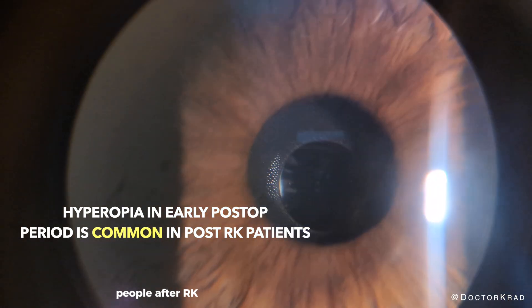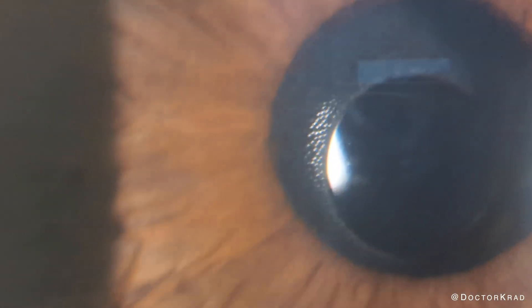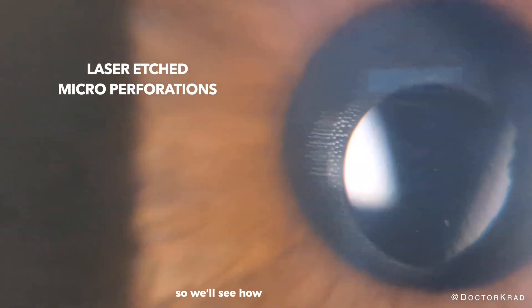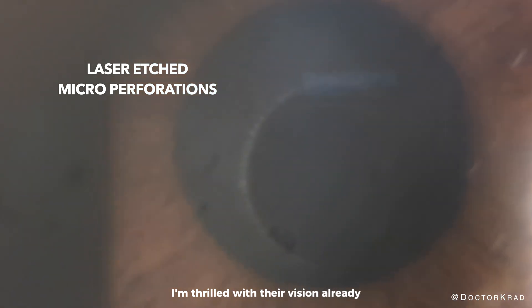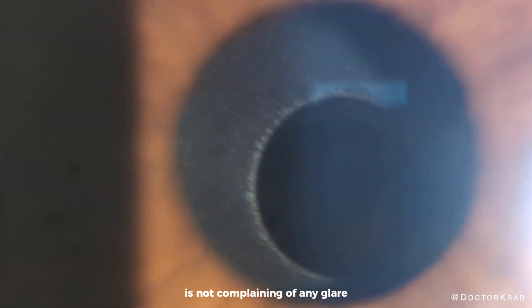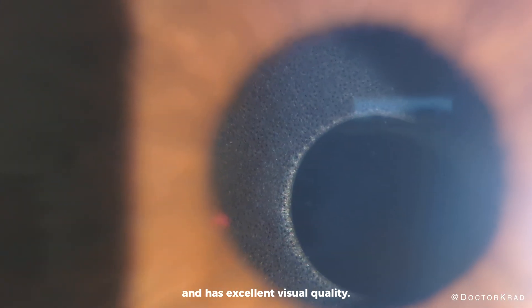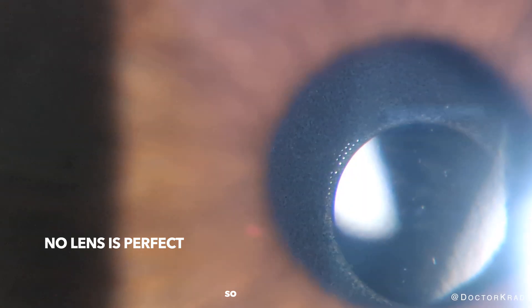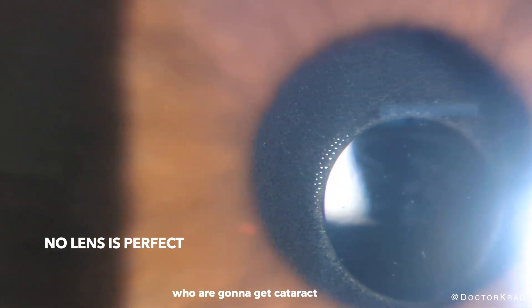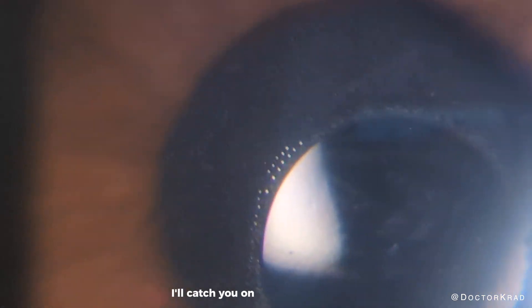People after RK tend to be hyperopic at first and shift in the myopic direction as they heal — this occurs over the first month or two. I'm thrilled with their vision already. The patient had RK and is not complaining of any glare, no dim light, no loss of peripheral vision, and has excellent visual quality. Consider this when you have patients going to get cataract surgery if they've had RK. Here I'm showing you the little laser-etched holes within the inlay of the IC8 Apthera. Thank you so much for your attention — I hope you found this video helpful. Peace.